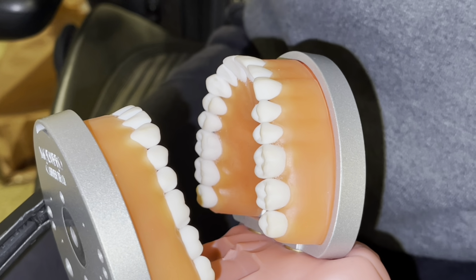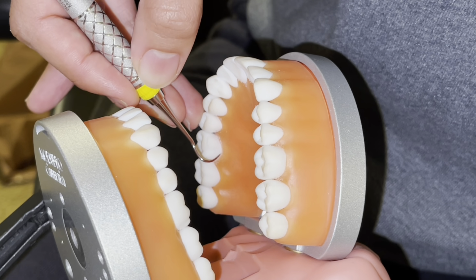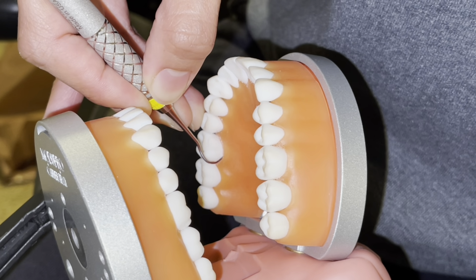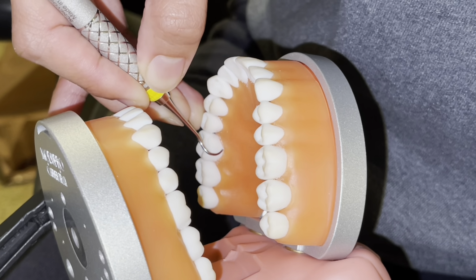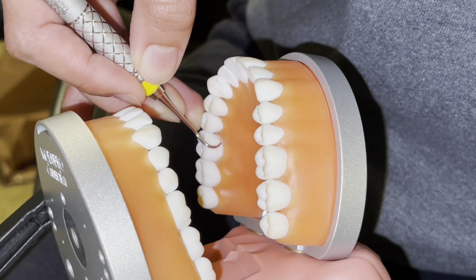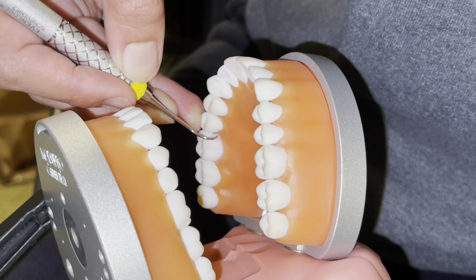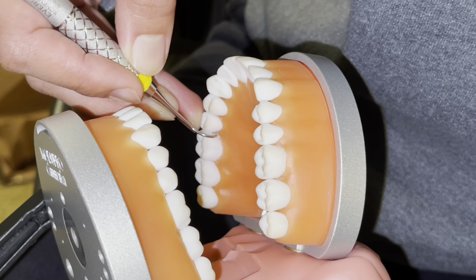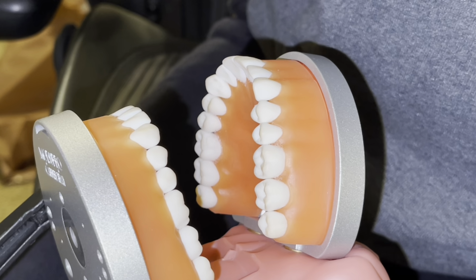Turn the instrument halfway, and then now your elbow is going to stay in and pivot out, and walk, pivot, roll, the elbow should go out, pivot, roll, the elbow is out, and you're going to do a lateral stroke up, down. Same for tooth number 4.